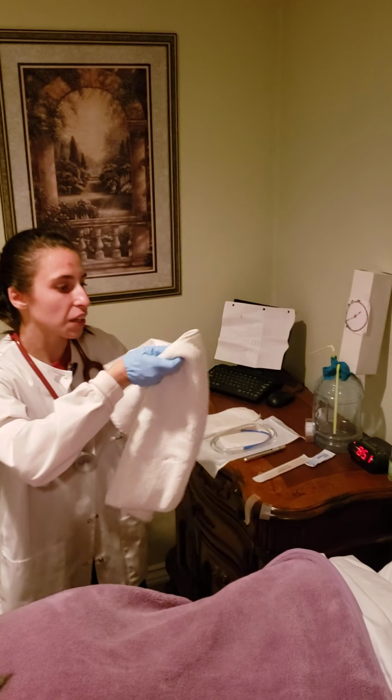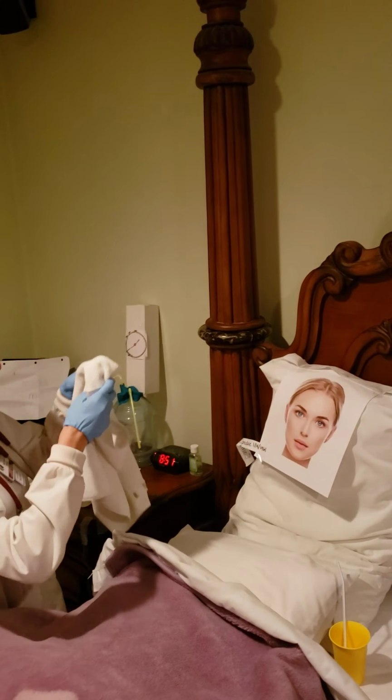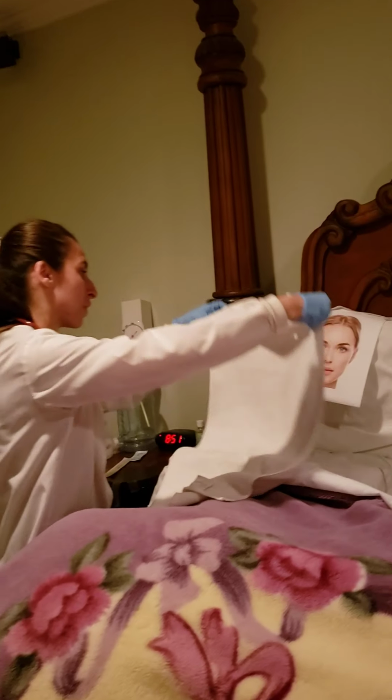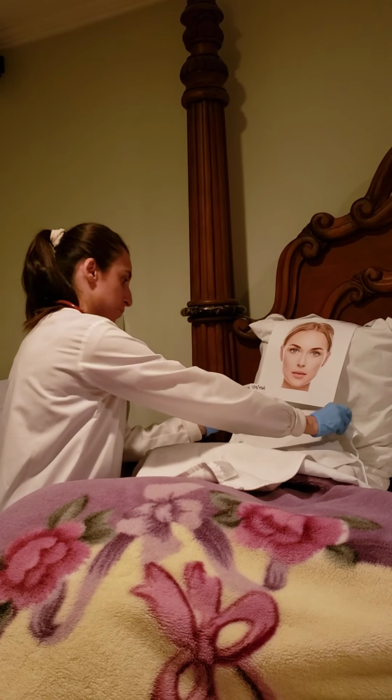And Ms. Carmel, I'm just going to place a towel on you, just because if anything gets soiled, I don't want it to get onto your gown or your sheets, okay?